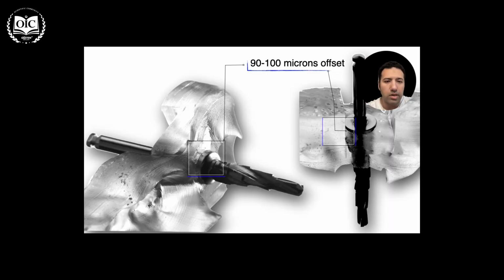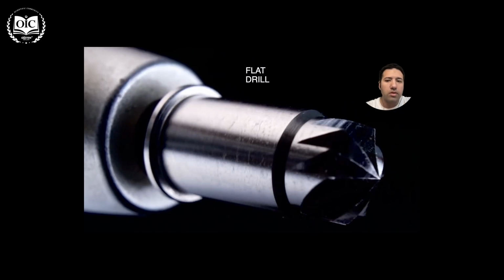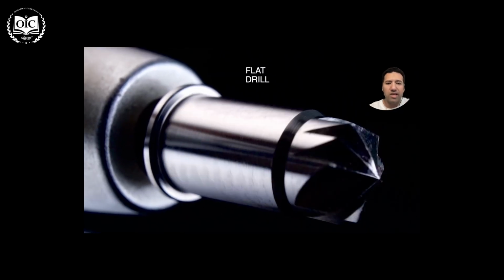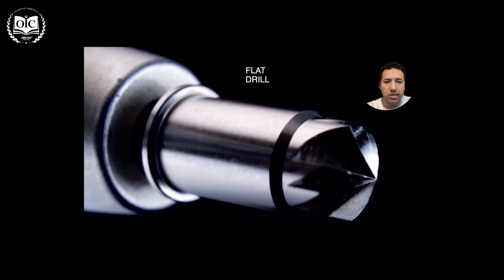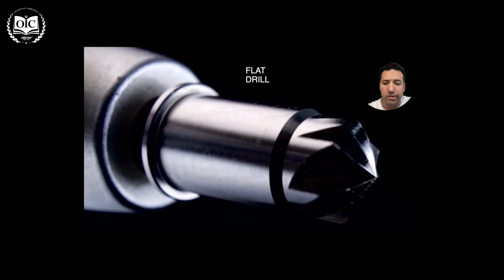We do a 90 to 100 micron offset for our guides in the OneGuide Kit, and actually this is dependent upon your printer and the resin that you're using. Most of the time these work with many printers and most resins. I just like to fix it 90 to 100 microns in all the guides. The next item is the flattening drill, one of my favorite tools to use with the guided kit and also with freehand implant placement.